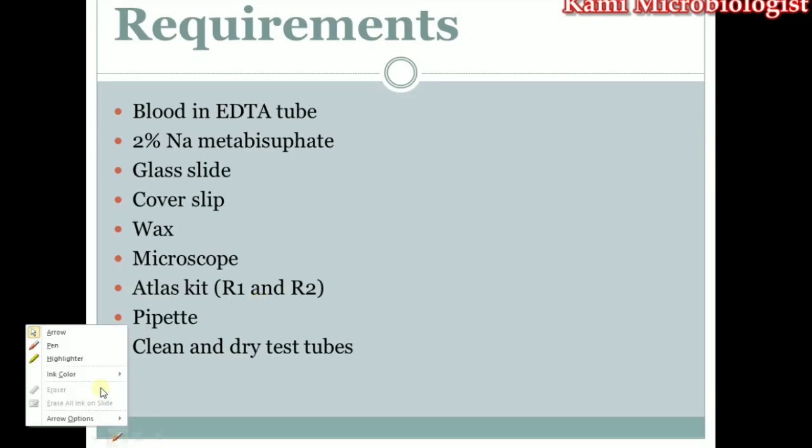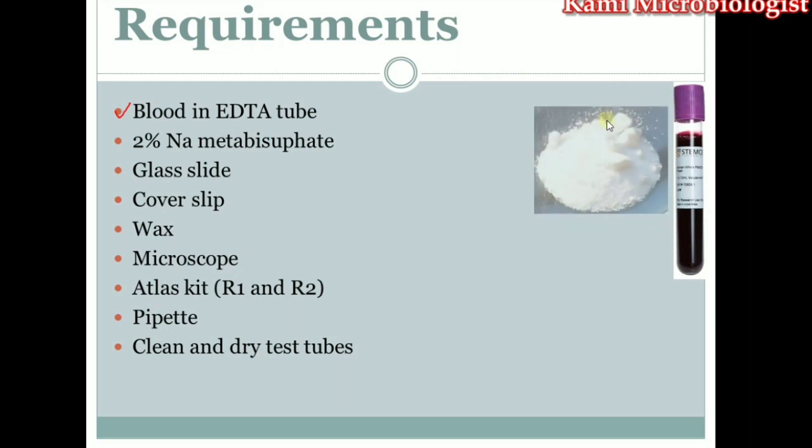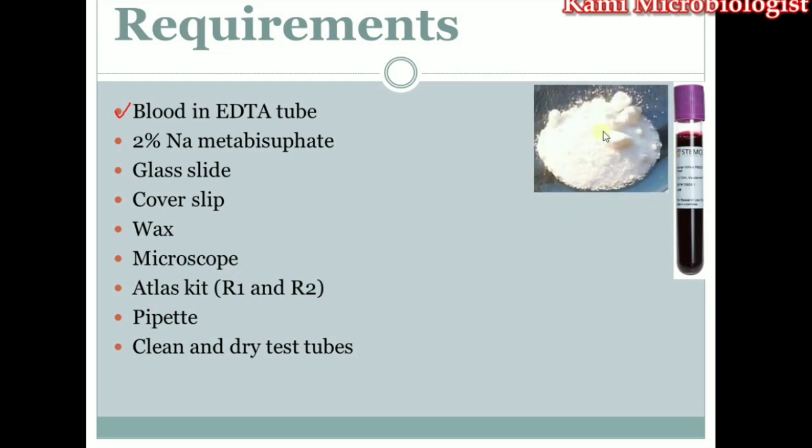Now what do we require while performing that test? In this test we need blood in an EDTA tube, as you can see. So we need blood in an EDTA tube. We need 2% sodium metabisulfite, as you can see.